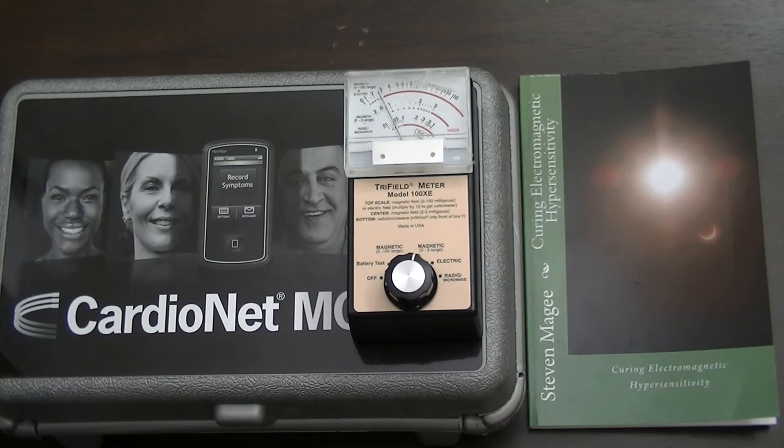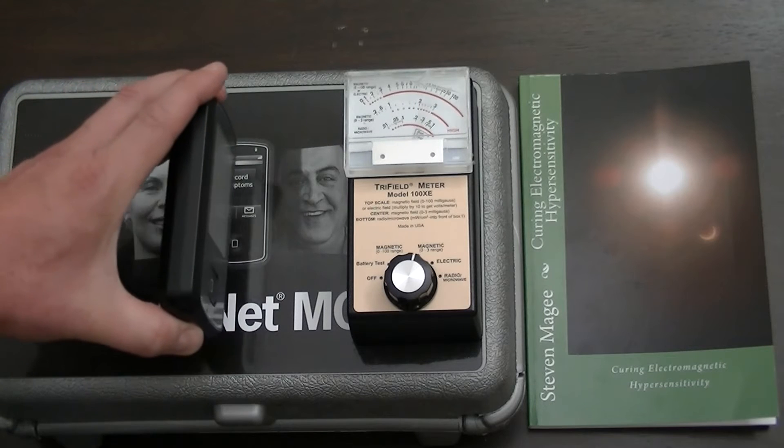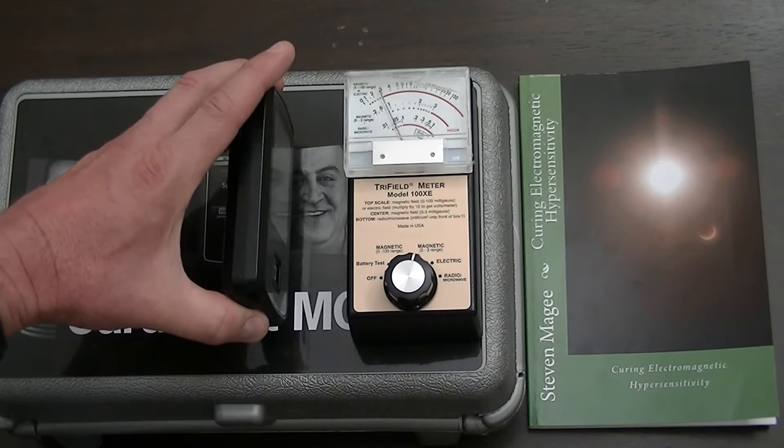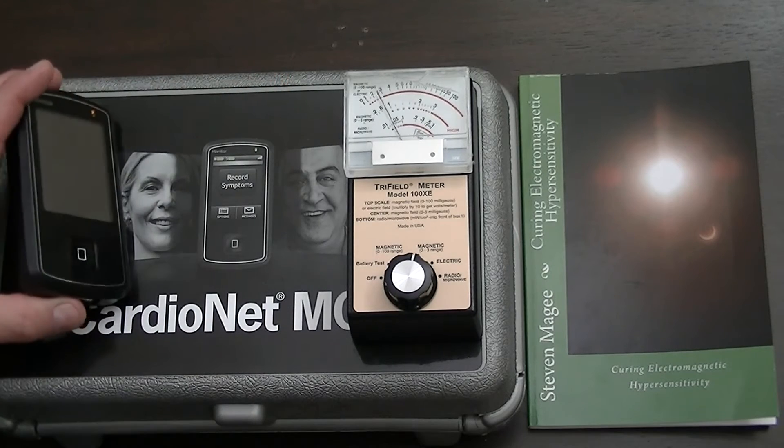The meter is going crazy at that distance. I'm going to take it about a foot away from the unit — we're still picking up on the field emission a foot away. Taking it about two feet away, there's a slight pulsation. But when we bring it up close, there's a very, very big disturbance taking place.